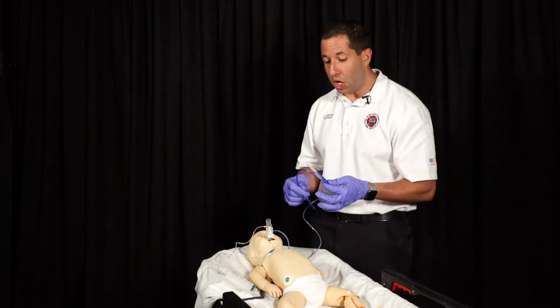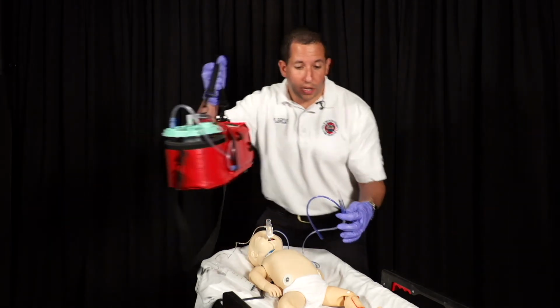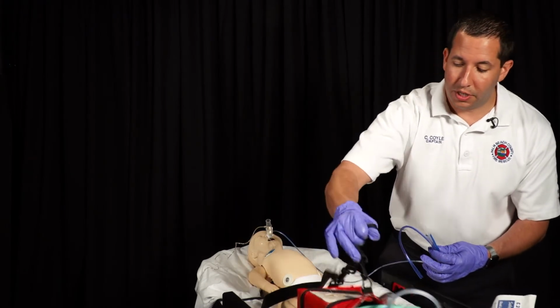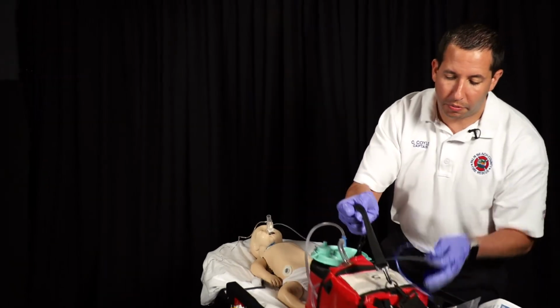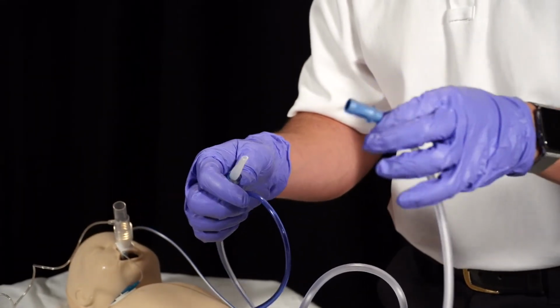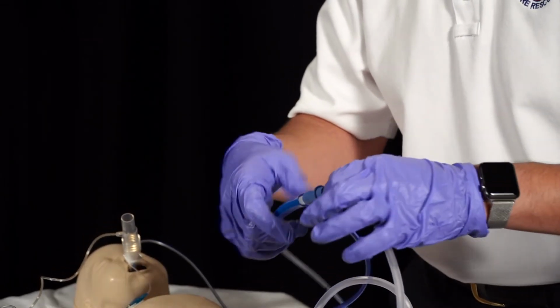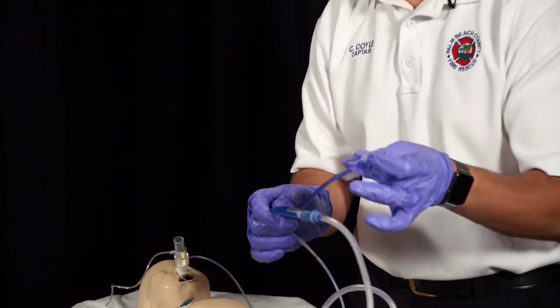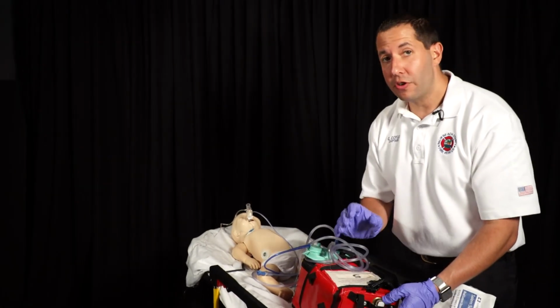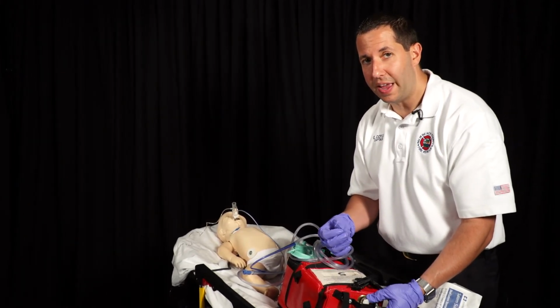If you're going to perform suction, I will tell you that you need to perform it only for a few seconds. And there's a couple of steps that I'm going to show you that can make it easy to perform the suctioning. This portion is designed to go on the running end of the suction tubing. After you've made this connection, again leaving the blue end open, you can now perform suctioning of the baby's stomach. However, this is something that's going to be done just for a short period of time, and that's to remove some of the air in the stomach.